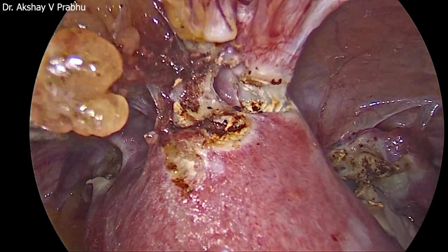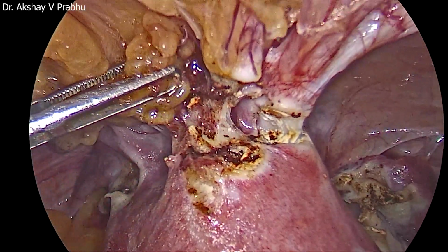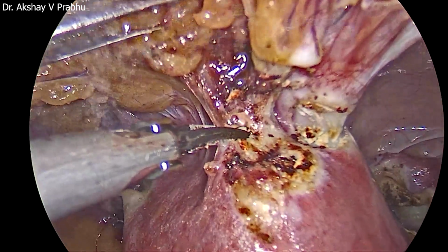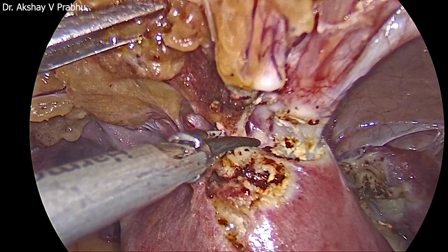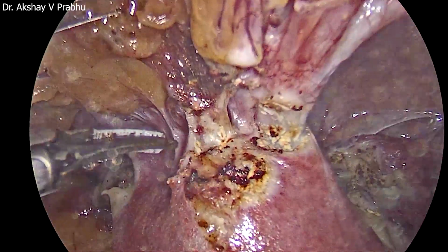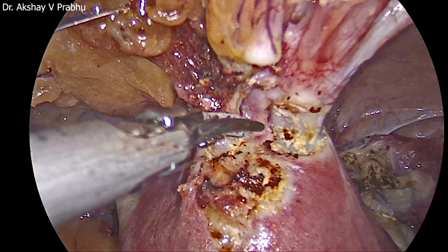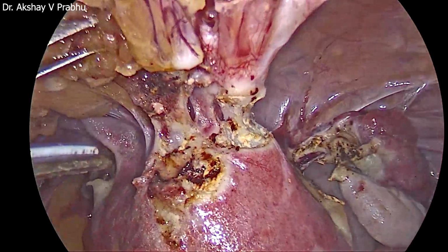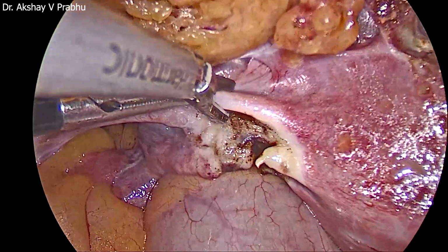But if there is no bleeding, then you can be assured that either you are cutting on the adhesion band or at the junction of the adhesion band and the organ. Till now we have not faced much vascularity, so we are going in the right plane. I'm cutting very much millimeter by millimeter just to expose and evert the adhesion band. Behind this adhesion band lies the urinary bladder which we have not reached.